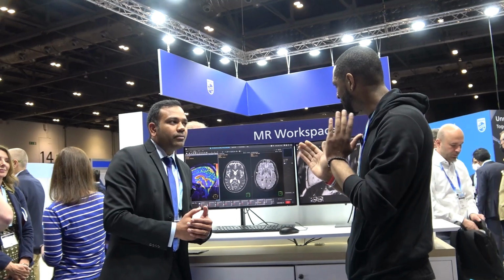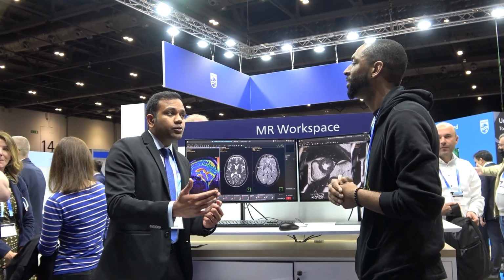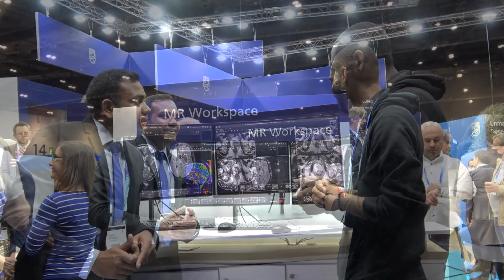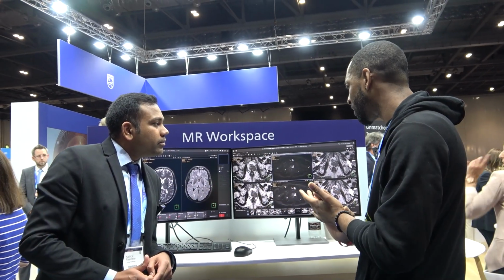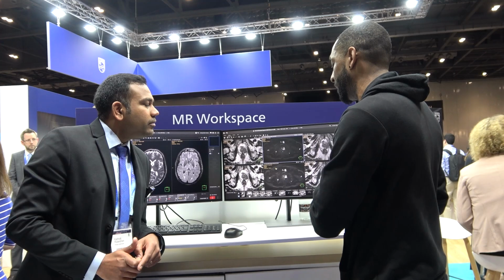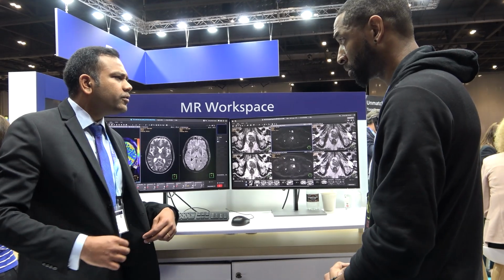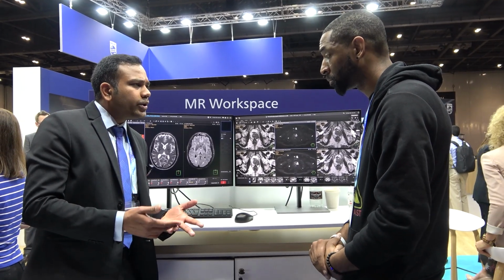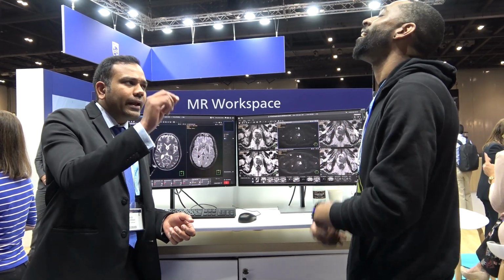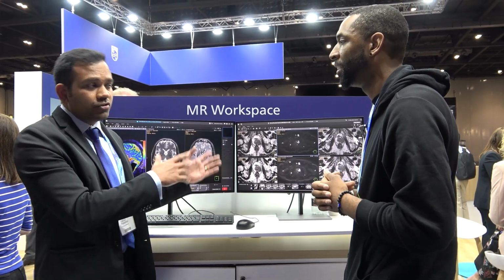Does it make the scan time any longer? A little bit, because you are using different nuclei, so it's a little bit longer, but the end result is you get more information. So you can image more than one nuclei. No, that's awesome. Are there certain restrictions on the type of sequences you can use, or is it its own type of sequence? For multi-nuclei, we can use different types of nuclei like phosphorus, sodium, carbon. And you're selecting that by a certain parameter? Yeah, you just select the type of nuclei with a single click, and the system automatically changes as per that nuclei.